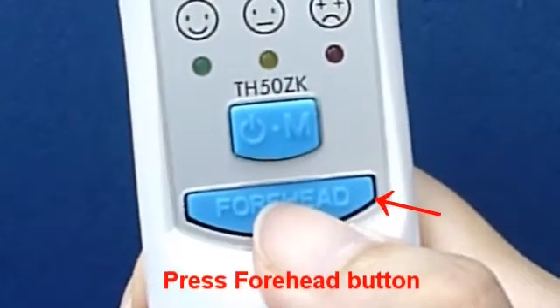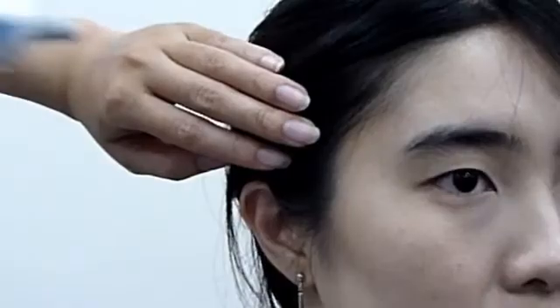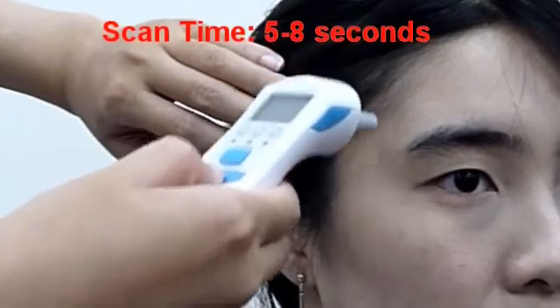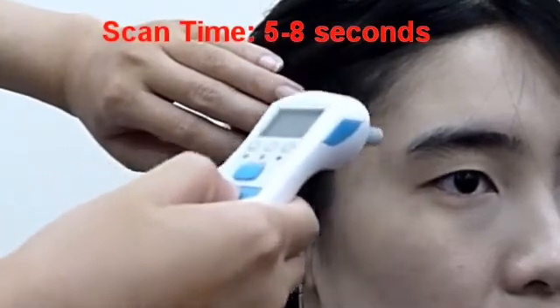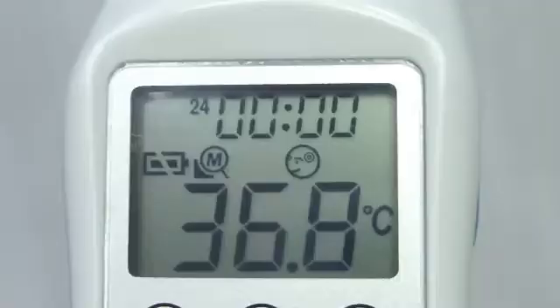Press the Forehead Button — you can see the forehead icon on the LCD screen. Gently scan around the temple area. The measuring time is between 5 to 8 seconds, depending on how long the thermometer takes to get the highest temperature.